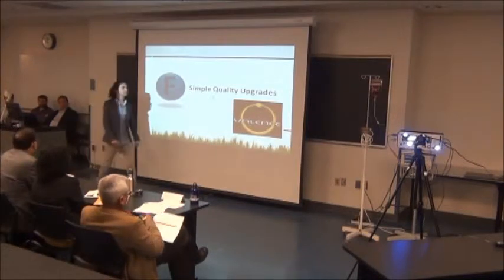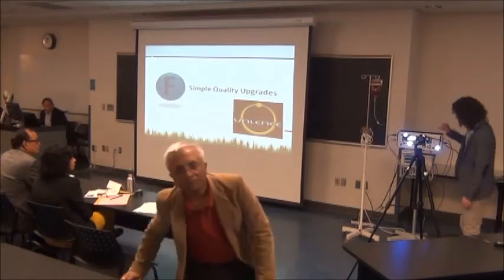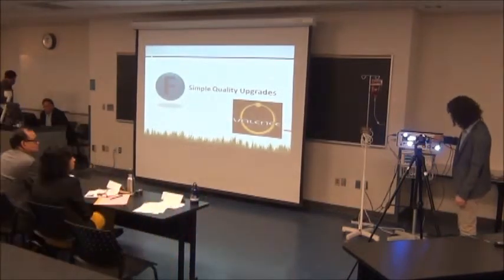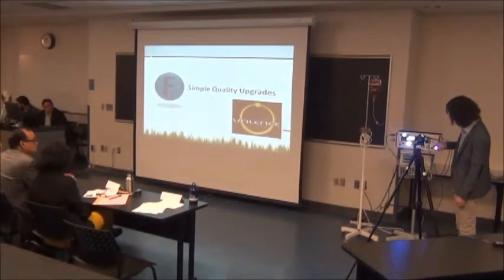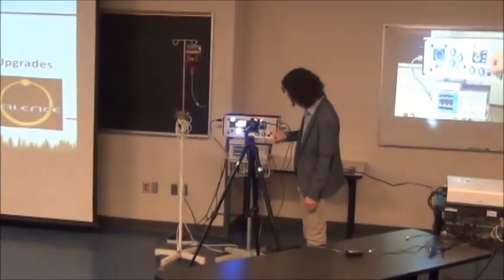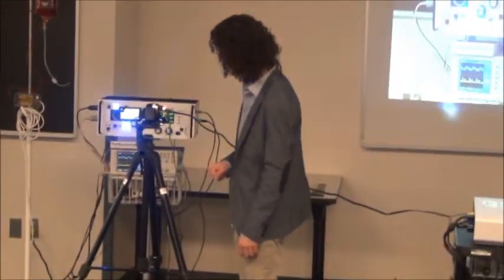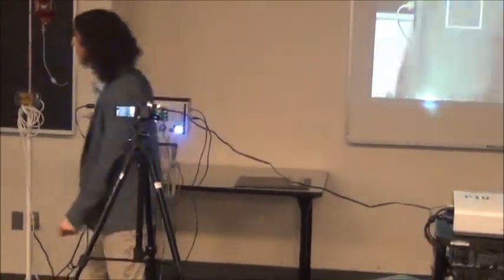I'll just go with a very quick demonstration of the device. On the display screen we have this number over here, which is the systolic, and right now it's 120, and the diastolic part is the lower number as we mentioned earlier, and it's actually 80 millimeter mercury right now.